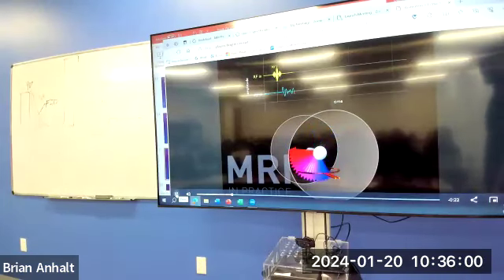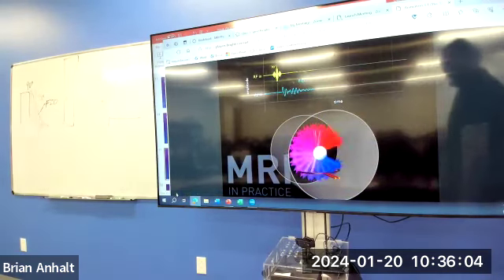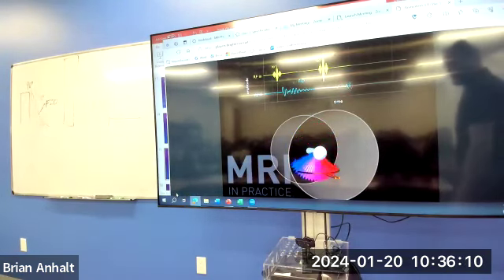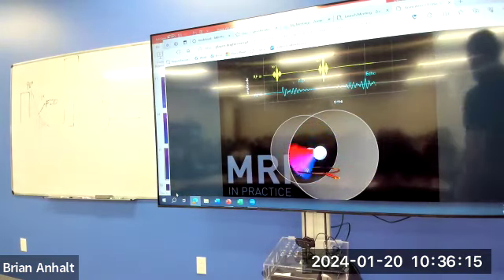Dephasing, see the coil losing transverse magnetization, so that free induction decay happens. 180-degree refocusing pulse. Now the faster ones are behind the slower ones. They eventually catch back up. I don't love this video because they actually go perfectly back into phase, which doesn't really happen.